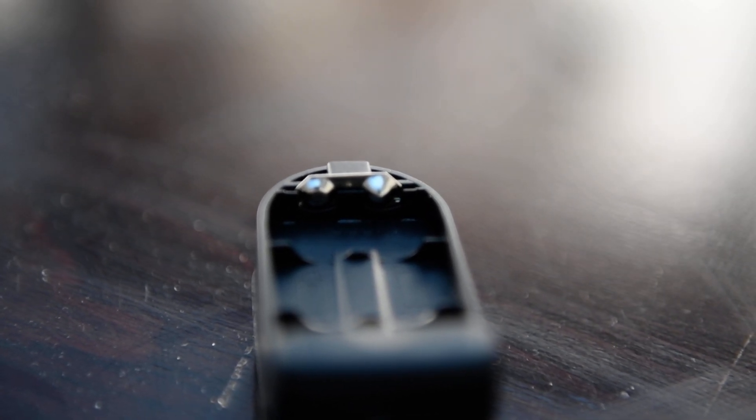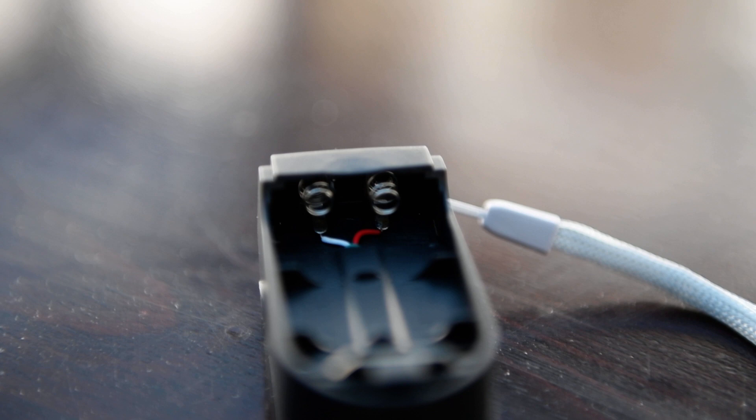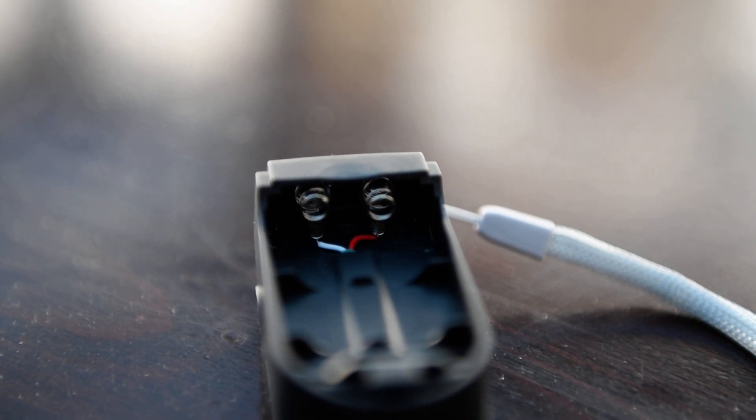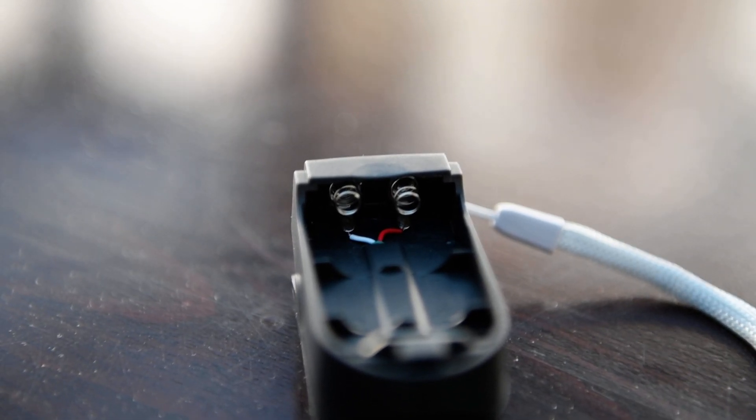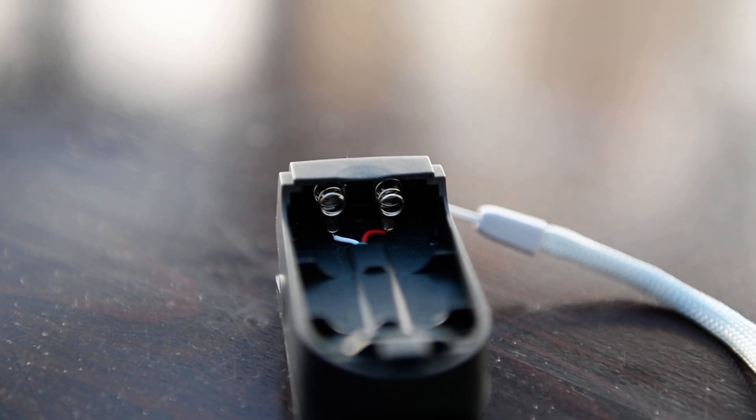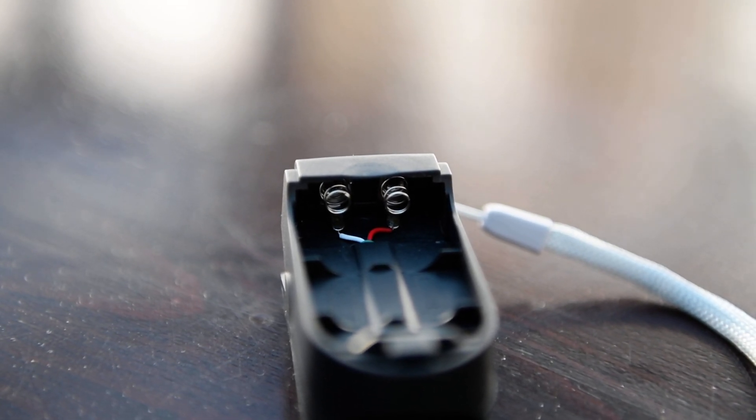We can see the contacts here are minus and minus, and plus and plus, so it cannot be used with regular batteries. You see the contacts — plus and plus, minus and minus.